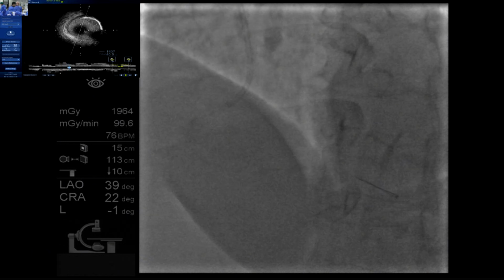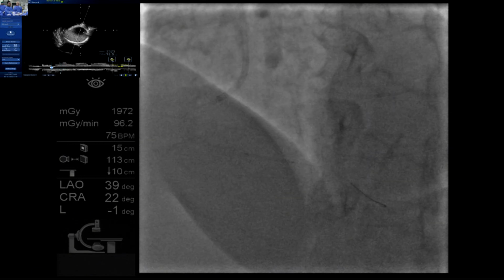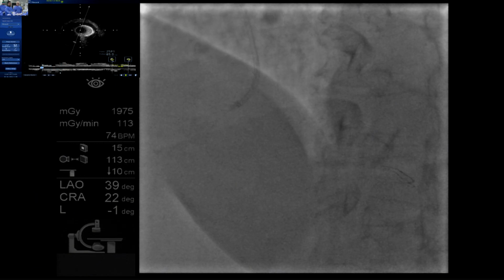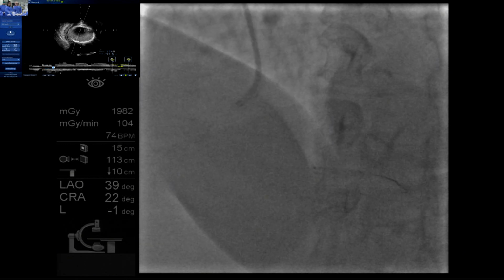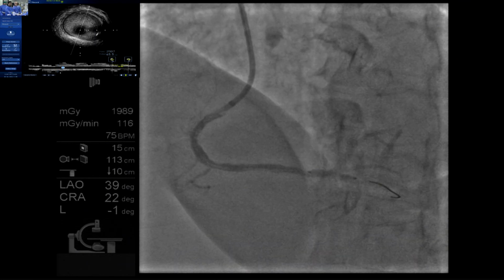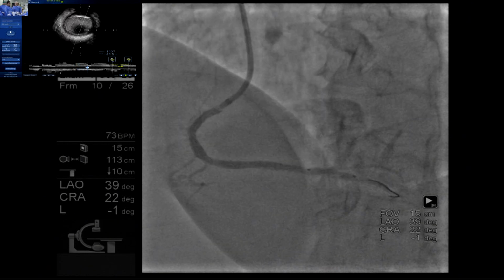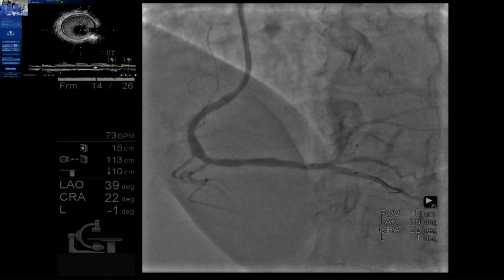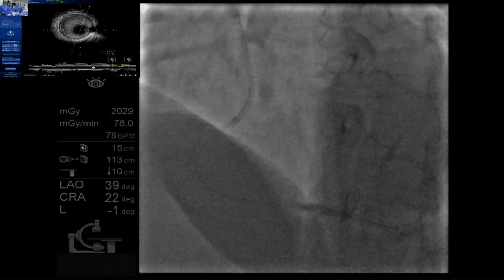So when we see reverberation after rotablation, that suggests that we have done multiple cracks. Yes. And that is the reason I think we can see a little more, the area behind the calcium. Otherwise, it is a low acoustic area, and you will not be able to see because the sound waves are not going to pierce behind the calcium. So that part will look like an echolucent area.